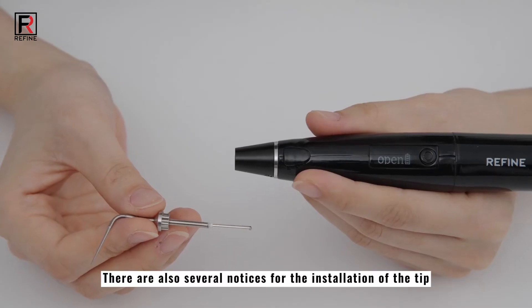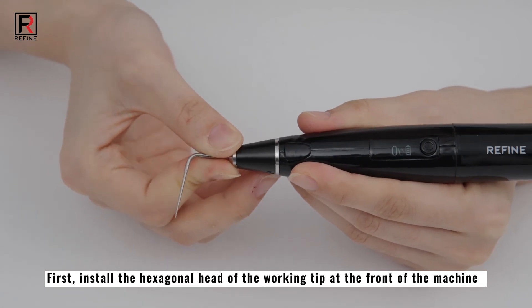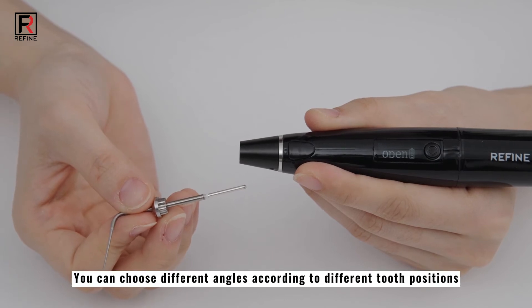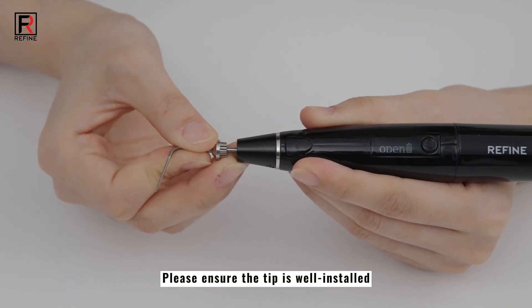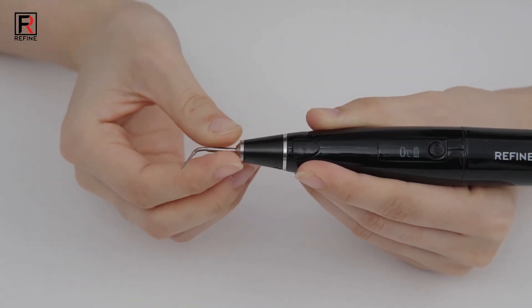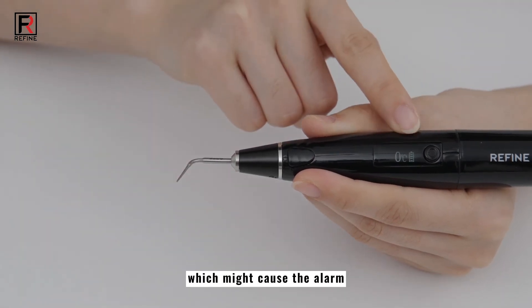There are also several notices for the installation of the tip. First, install the hexagonal head of the working tip at the front of the machine — 6 angles can be chosen according to different tooth positions. Please ensure the tip is well installed; otherwise, the machine screen will display an alarm with 'open'. Do not polish the tip to avoid breaking the hot solder joint at the front, which might cause the alarm.